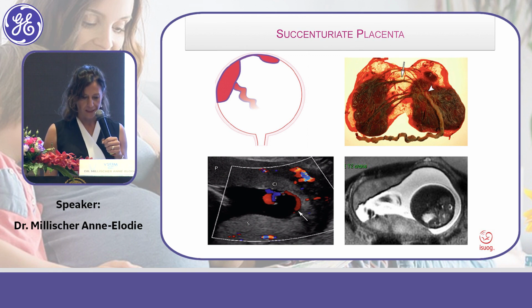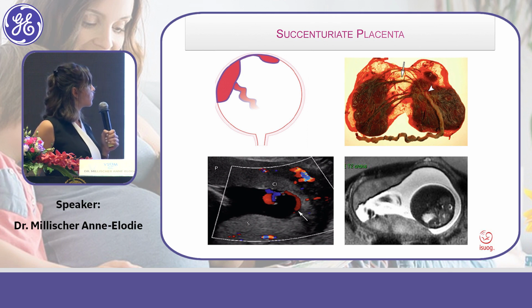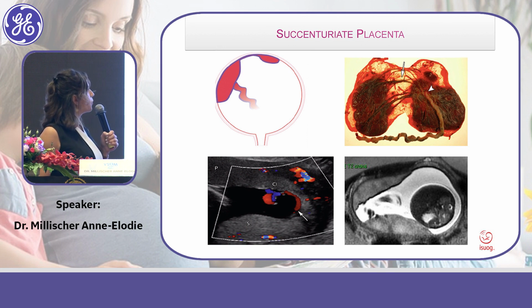Theo cái hệ thống đó, mình đầu tiên sẽ đi vào đánh giá cái hình dạng của bánh nhau và cái đặc điểm, cái biến thể đầu tiên của bánh nhau tôi muốn khảo sát đó là bánh nhau có bánh nhau phụ. The definition of this kind of placenta is the presence of two lobes, as you can see here, with vessels going through the two parts of this placenta.